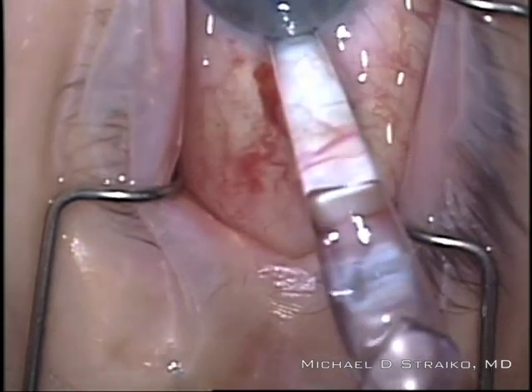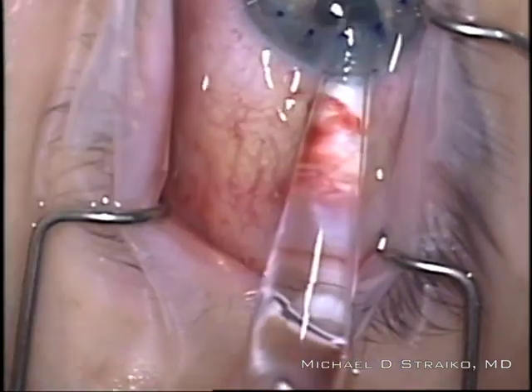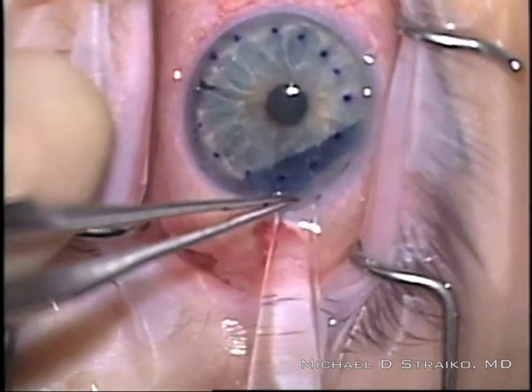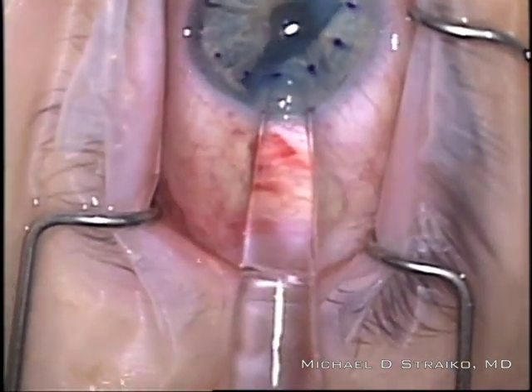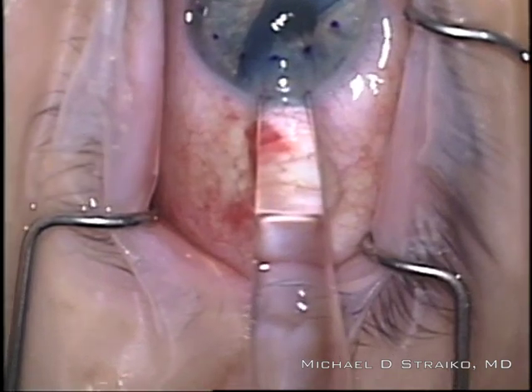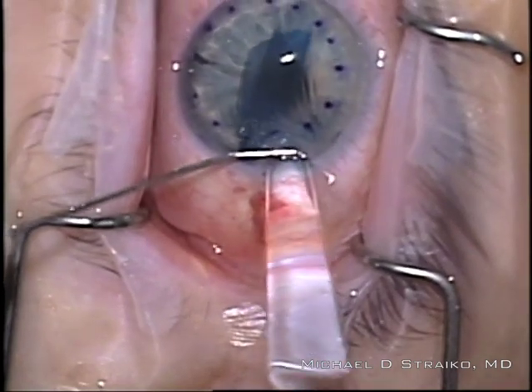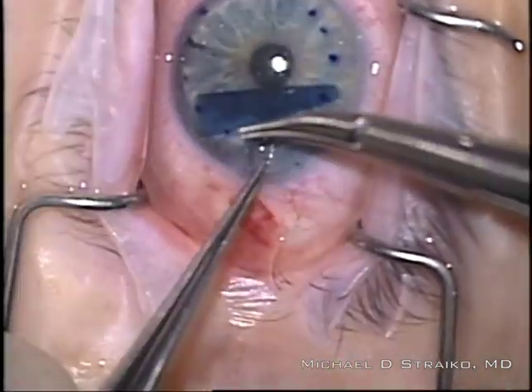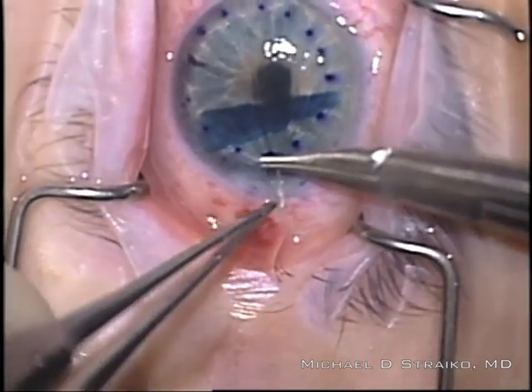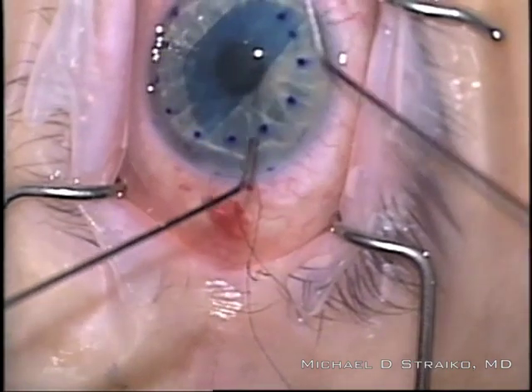I use short, quick bursts of fluid, not over-pressurizing the eye, and I'm decompressing the paracentesis. I give it another jet of fluid. The graft turned 90 degrees so I think I'm in good shape, but you really have to watch out — and that's why I chose to show this — the graft likes to follow fluid currents. That graft wanted to come out. I'm kind of trapping it with my cannula, then removing the injector. I need to keep the eye at a low pressure so that the graft does not follow fluid out of the incisions. I suture the incision with a single suture.